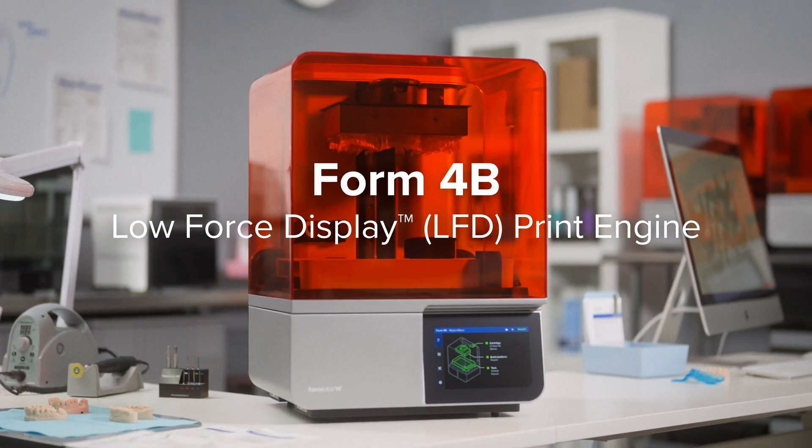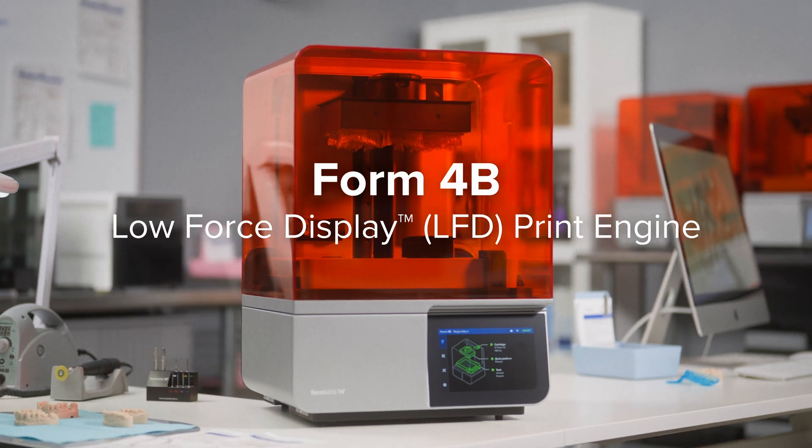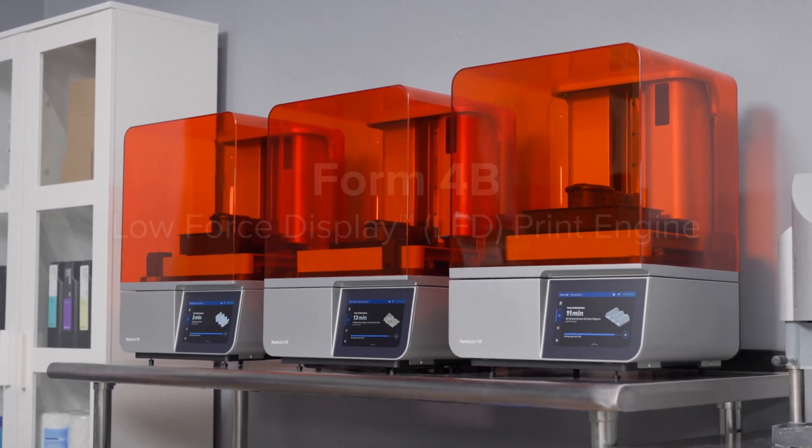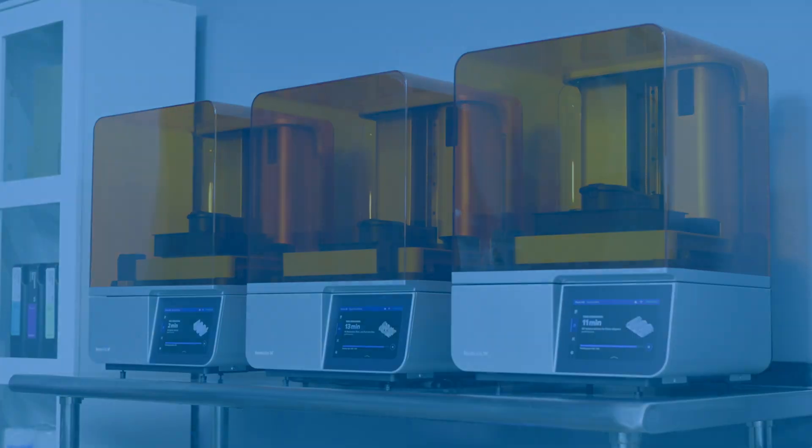This is Form 4B, powered by our low-force display print engine — a completely transformed tool that will revolutionize the way you fabricate dental parts and serve your patients.